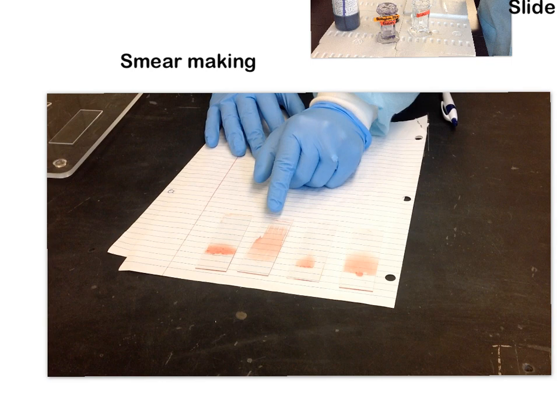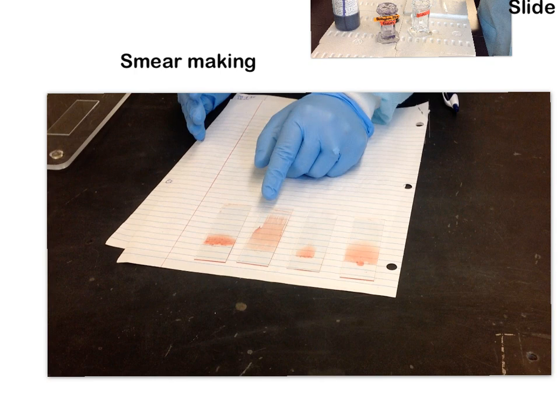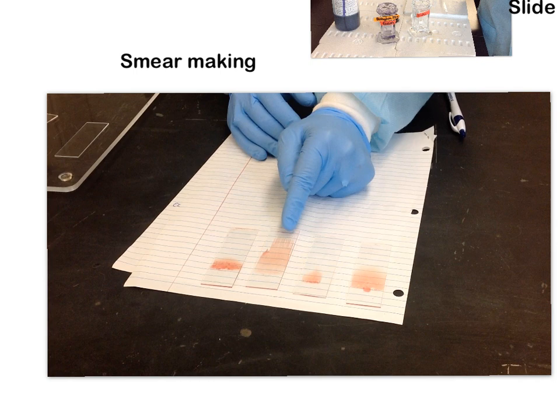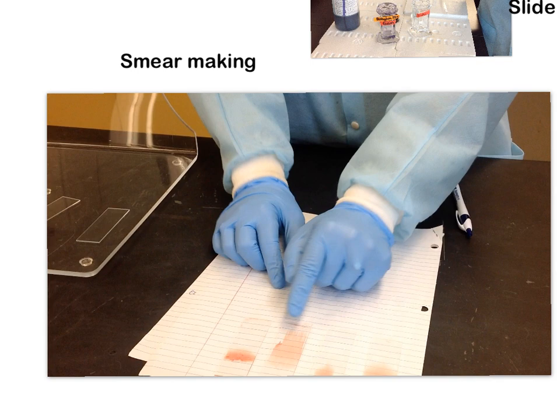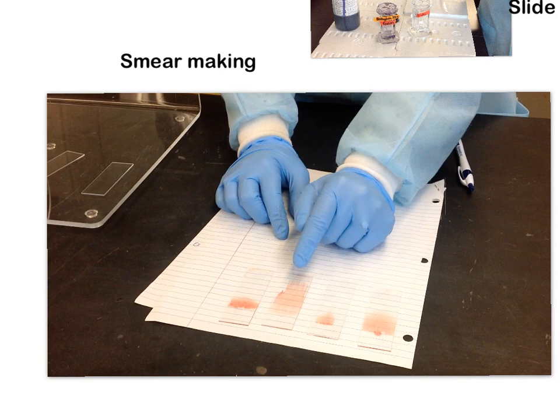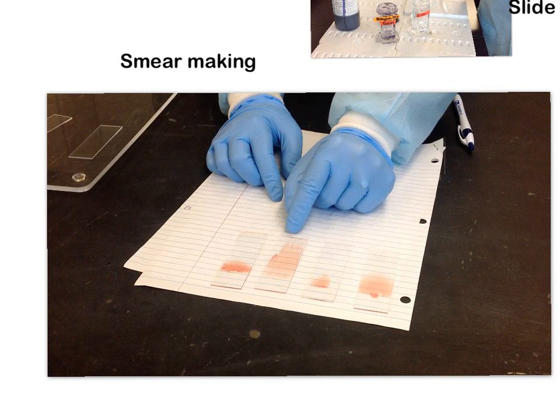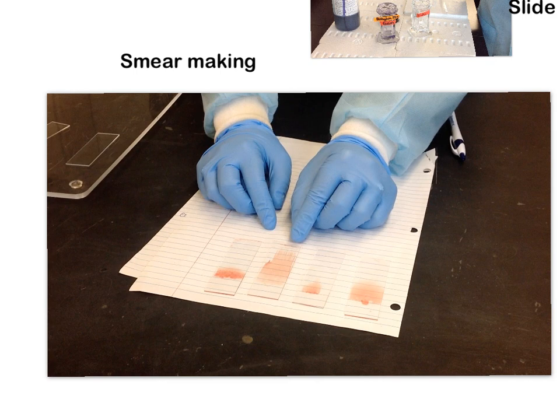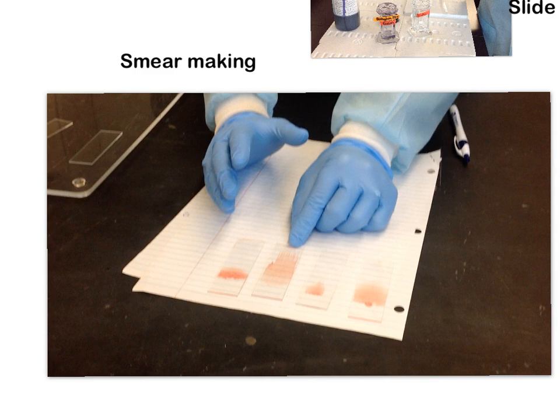This other smear is really long and really thin, so it's going to take forever to find an area with a good representation of cell morphology. You can also see spiky ends at the top — these are very bad because the cells get spread out and flattened, making it difficult to tell morphologies. There's also a flat top, which is impossible to look at because everything is just jammed together with no way to differentiate one cell from the next.